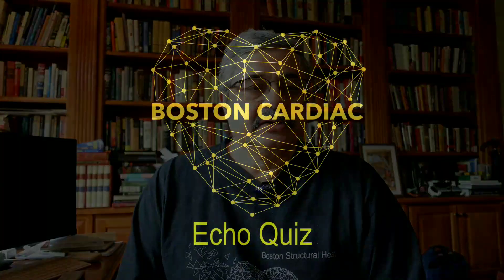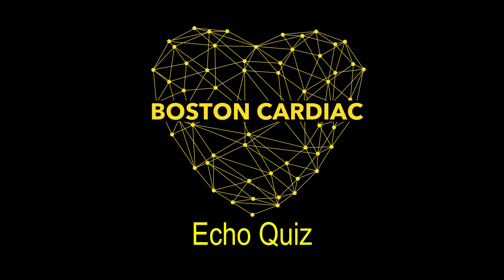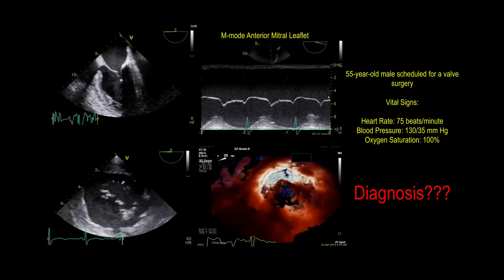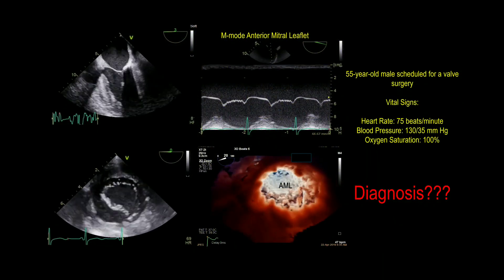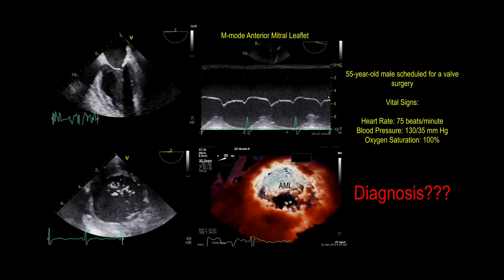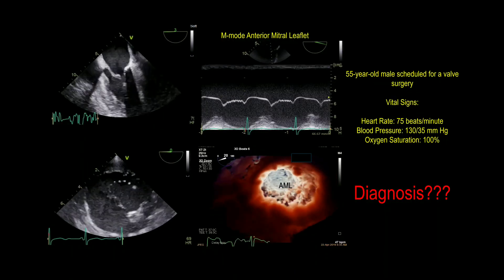So let's get started with this echo quiz. This is the clinical history: these are the echo images of a 55-year-old male who is scheduled for a valve surgery.